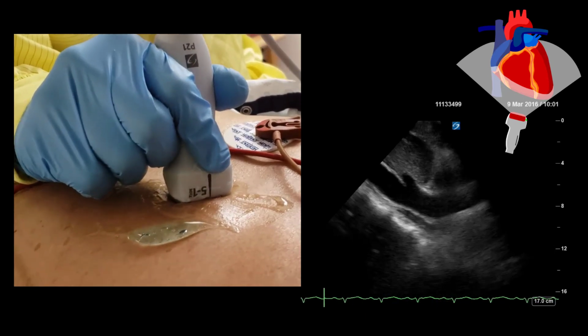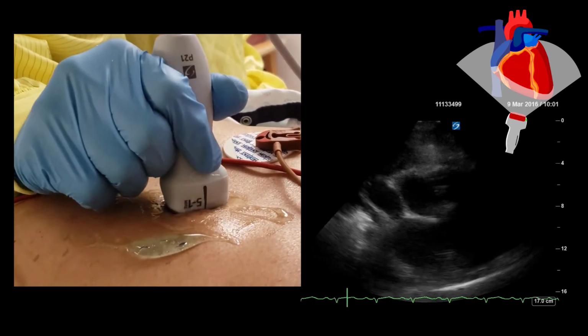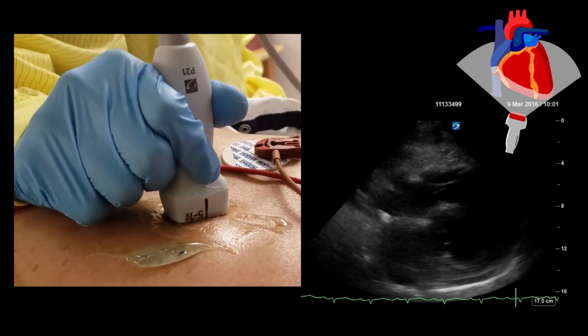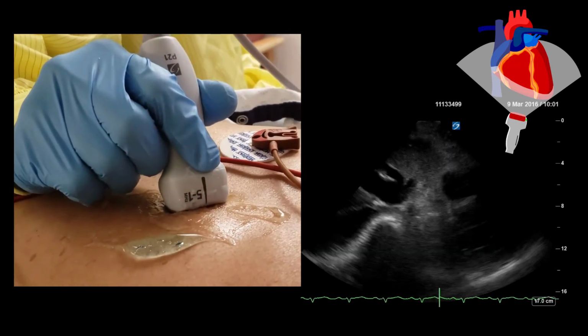Essentially, we are bringing things that are in front or behind the image displayed on the screen, as seen in this subcostal 4 chamber view, where you can see as we are fanning, we are bringing the IVC, the RA, and the aorta into view in different angles.